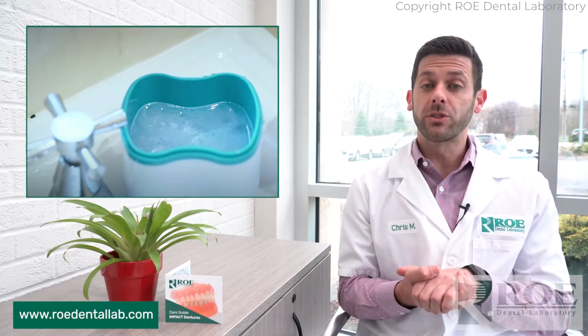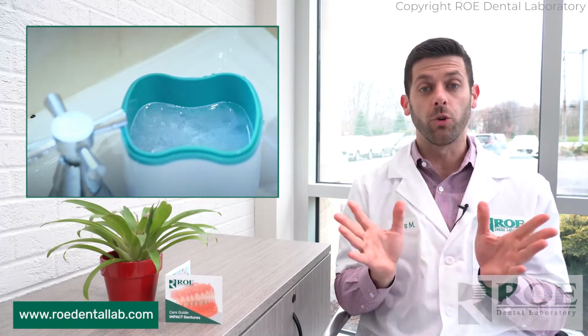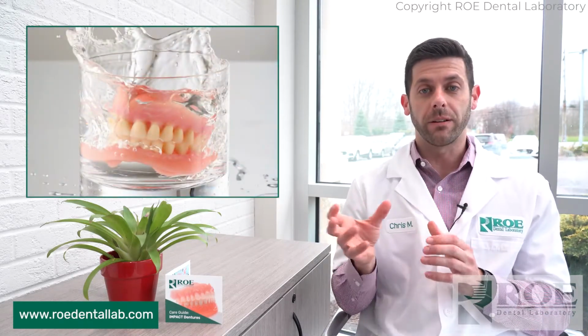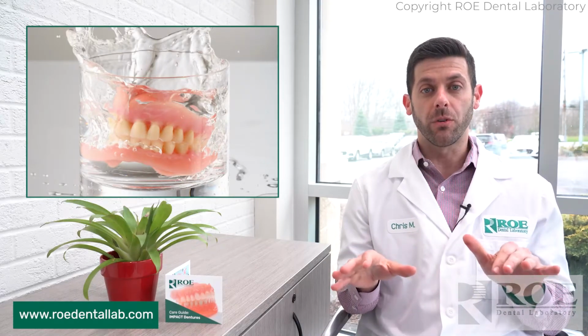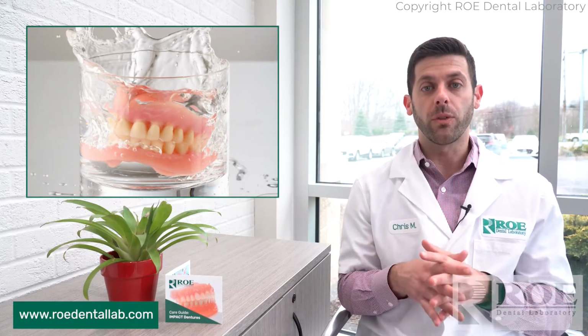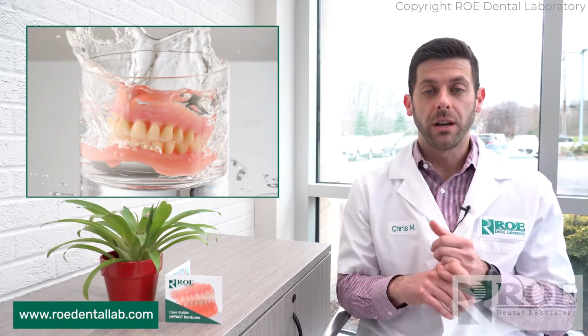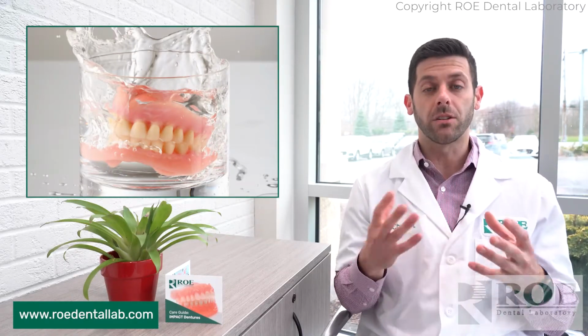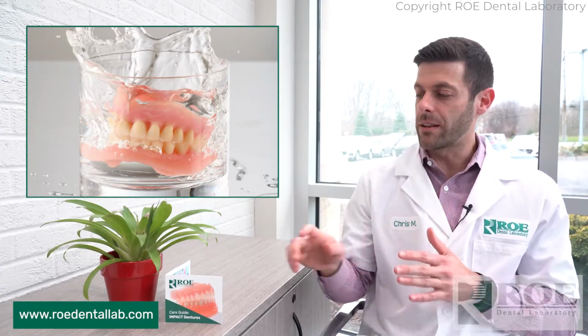But if it's going to be stored overnight, we want to make sure that they store it just in cold water. So a glass by their nightstand, drop it in cold water. That's it. That can be stored overnight. Keeps it nice and moist for the morning. We don't want them storing it in any kind of mouthwash or anything that can discolor that denture. So that should be about it on that.